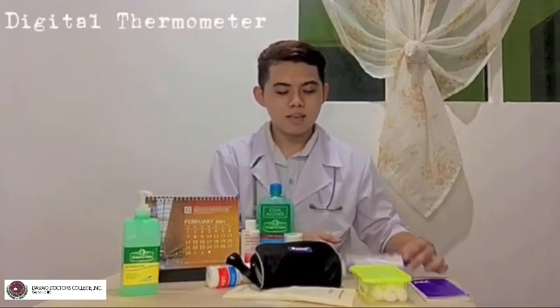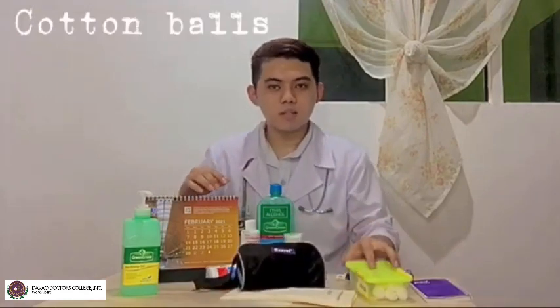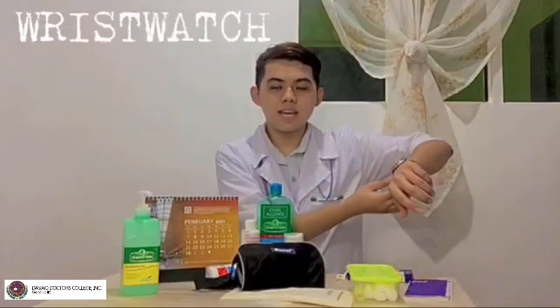here. After verifying the need to perform the assessments, we will now proceed with the preparation of our equipment. The things that we need to prepare are, of course, the thermometer, this is digital, the sphygmomanometer or the BP apparatus, the cotton alcohol, the notebook and pens, and the wristwatch that has a second hand on it.